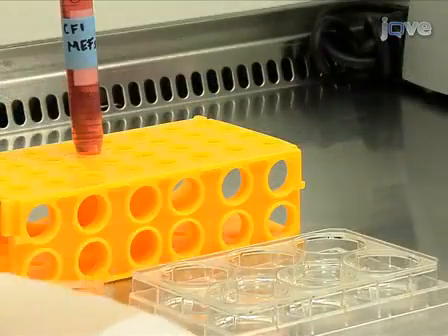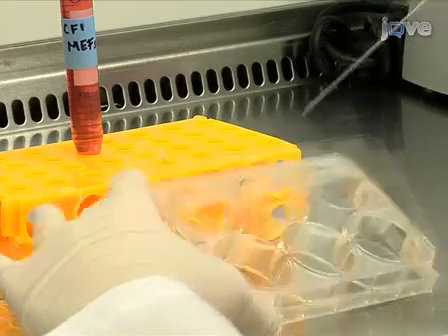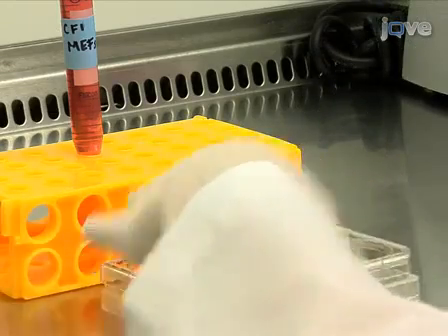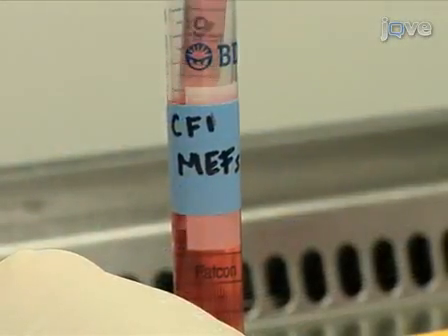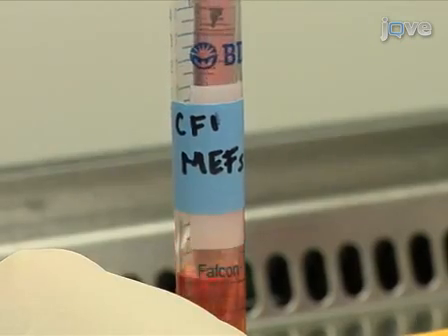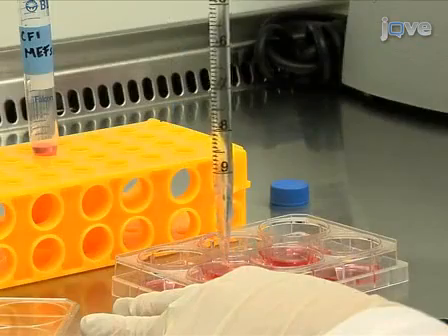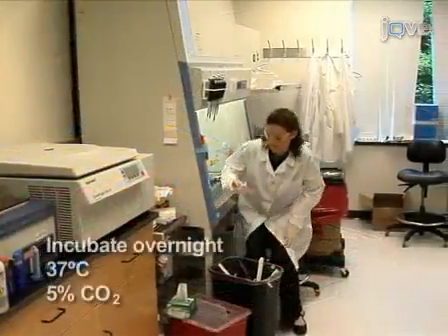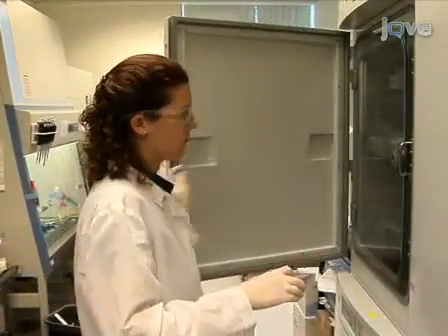One day prior to thawing human ES cells, plate a feeder layer of irradiated mouse embryonic fibroblasts, or MEFs, in MEF culture medium in one well of a gelatin-coated 6-well tissue culture plate. Incubate the plate overnight at 37 degrees Celsius and 5% carbon dioxide.